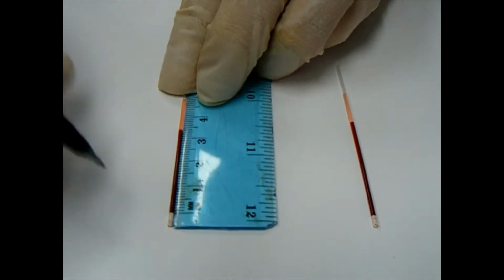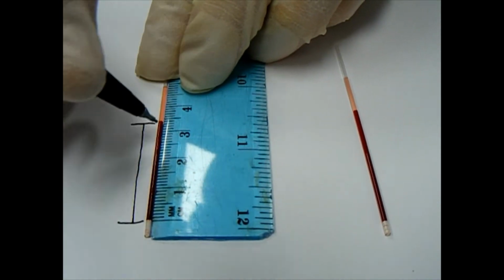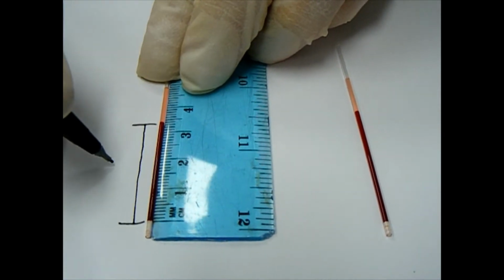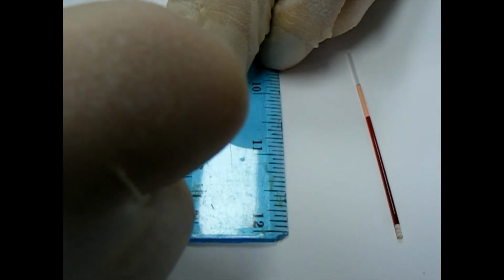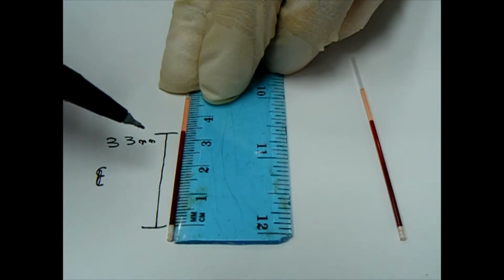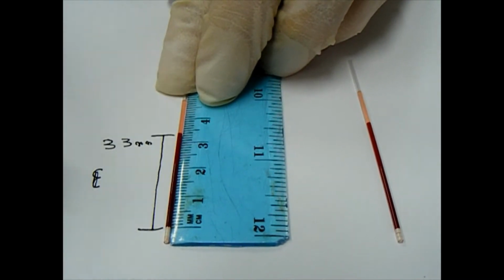The first one is from the bottom of the blood to the top of the blood. So you're just measuring the blood column. So the blood column there is 33 millimetres. Sorry, I'm trying to write upside down for you. 33 millimetres. Now it doesn't matter if you use millimetres or 3.3 centimetres, you could use metres, as long as the measurements are all in the same units. So I like using millimetres.